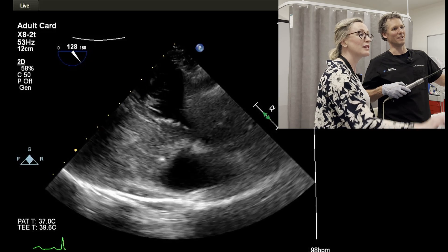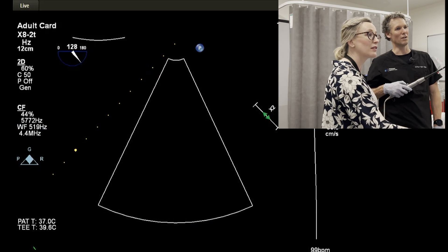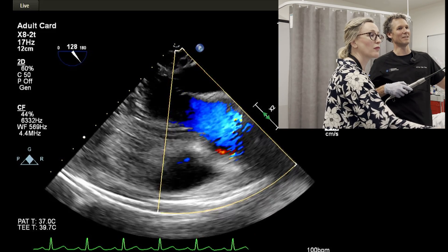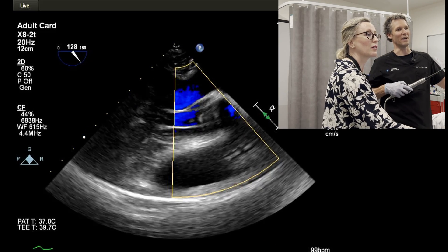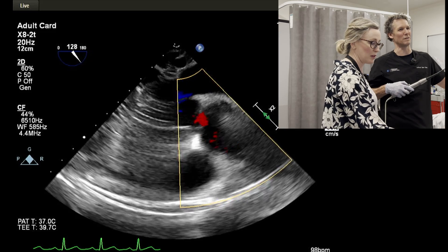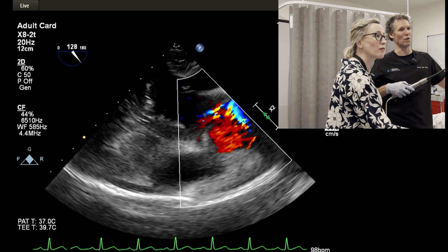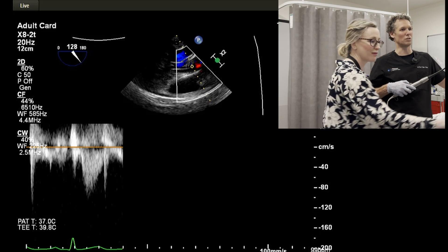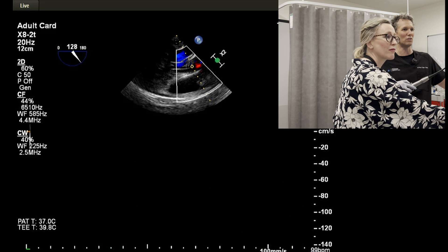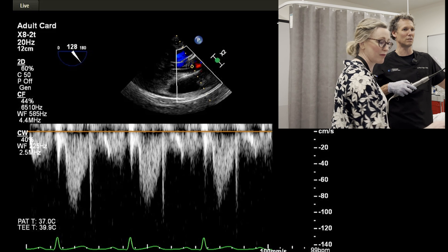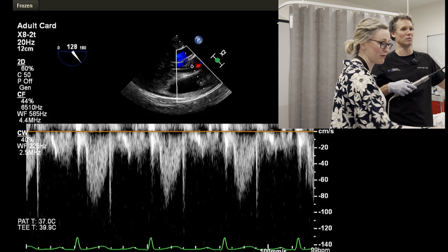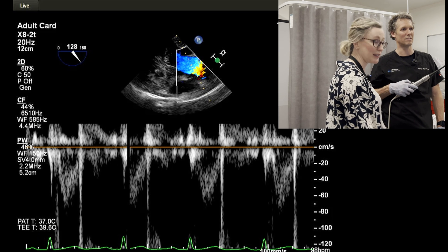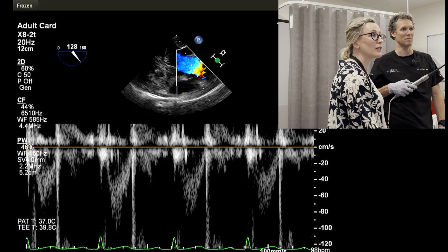It's not perfect, but you get the idea — that's not a bad view. So looking at the aortic valve, 120 gastric view, not a mid-esophageal view, and you get quite a nice alignment there. A second bite of the cherry — TOE is not great for Doppler angles obviously, but you do what you can with the views that you've got. The deep gastric was a little challenging, so here we can try the gastric 120 view — continuous wave Doppler to try and have a look at the flows through the aortic valve. We can do pulse wave Doppler as well. Our angles are off by about 30 degrees at least, so I wouldn't fully trust that, but it gives you an idea — and sometimes that's the best we've got.